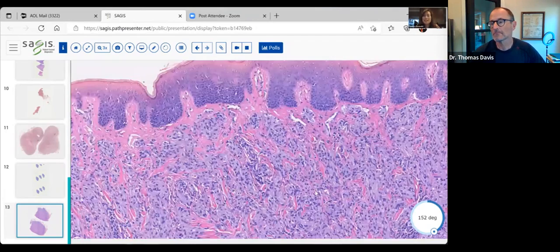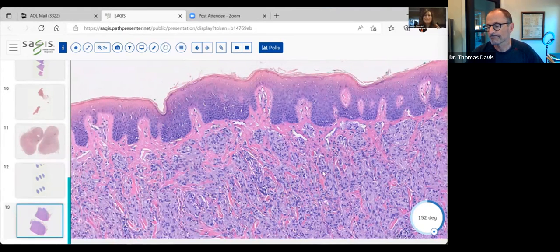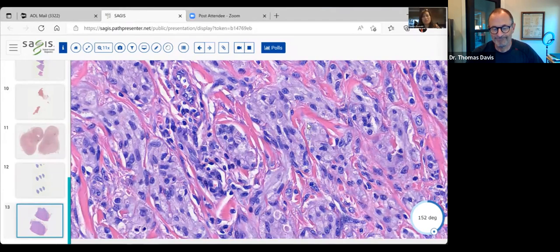And he correctly identified that what he was doing was not Mohs on a squamous cell carcinoma, but instead a granular cell tumor, and called us promptly. What a great diagnosis, right? A great catch. But usually, again, these are found on the tongue, and these are neural tumors. Because of the mauve color, sometimes I call these marvelous tumors, and I hope that they are marvelous too.